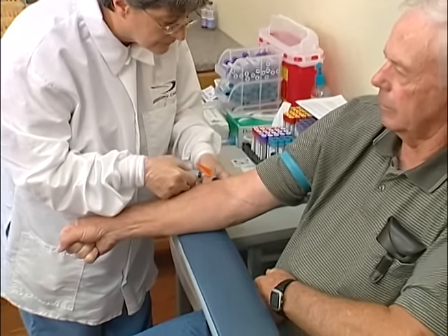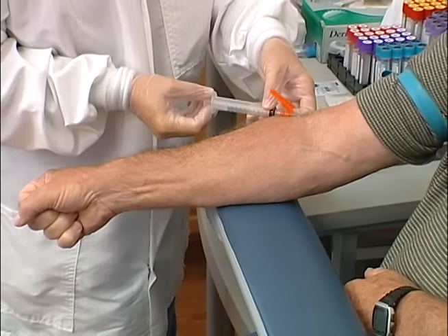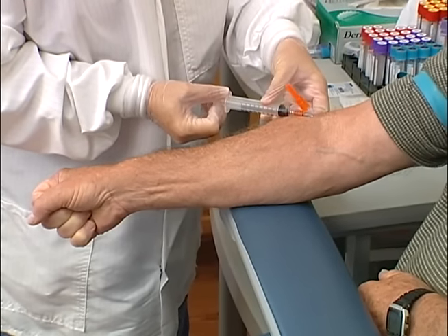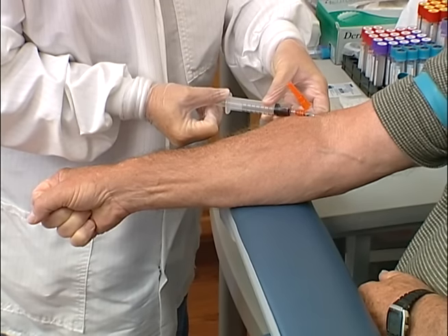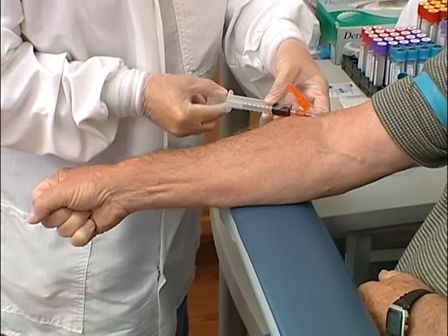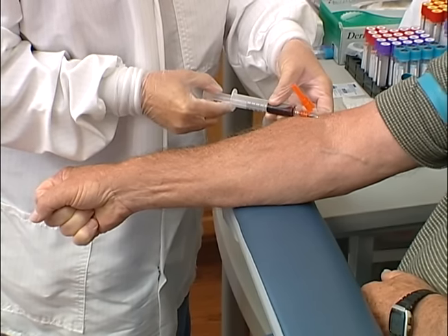With the thumb of your free hand, pull downward from below the intended puncture site to anchor the vein and tighten the skin. Hold the syringe at the fingertips and, with the bevel up, move the needle forward through the skin at a 30 degree angle or less until you perceive to be in the center of the vein.